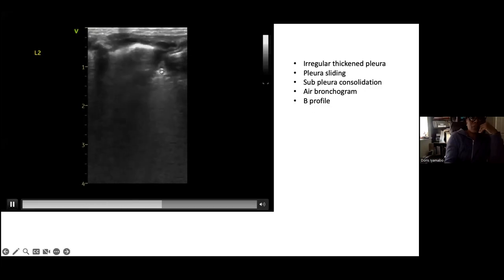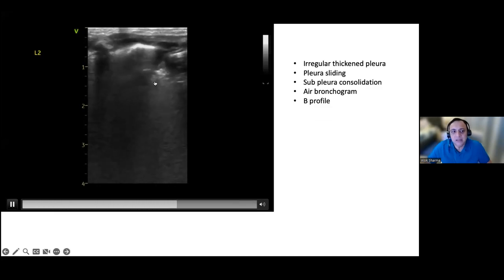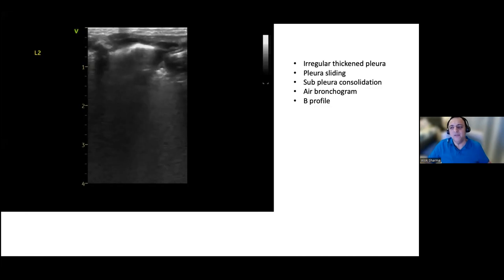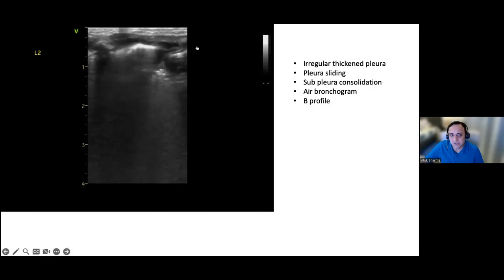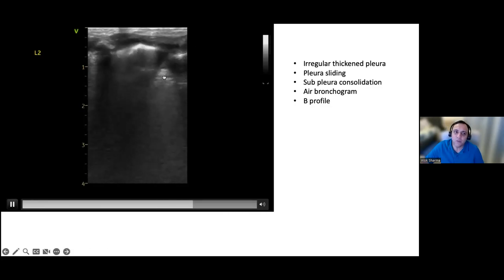Okay. I was a little bit confused because I was wondering, why is it separate from the pleura? It's just, you're not aerating. So what is happening is, what does aeration mean? Everybody kind of thinks aeration means we should see visible A lines. But actually, in order for you to see a B profile, you still have to have air coming into the lung. If you have absolutely no air coming into the lung, then really what you'll see is complete atelectasis. But here you've got air which is coming up to that margin. Just put your arrow over the static air bronchograms. Yep, beautiful. So that's where air is penetrating up till. And you're not getting air penetrating beyond that. For that reason, you're getting that appearance of the pleural line not being established.